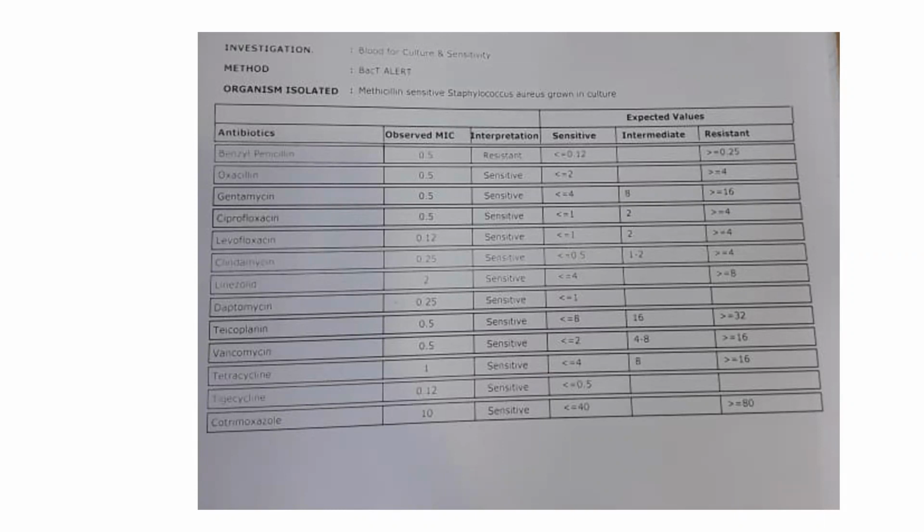Let's say the benzyl penicillin, oxa, gentamicin, and ciprofloxacin. These are all decided because it is a gram-positive organism, and these are the antibiotics which have a gram-positive cover.